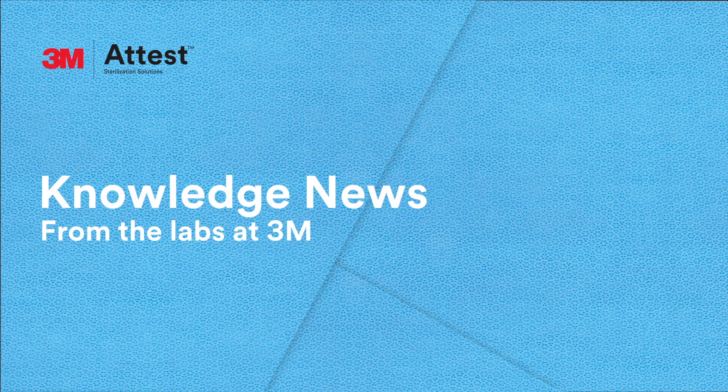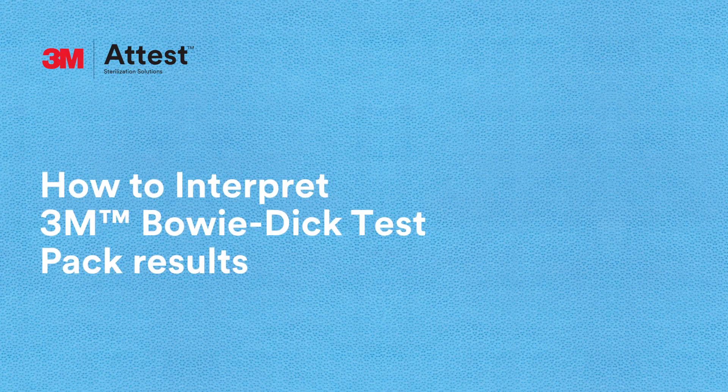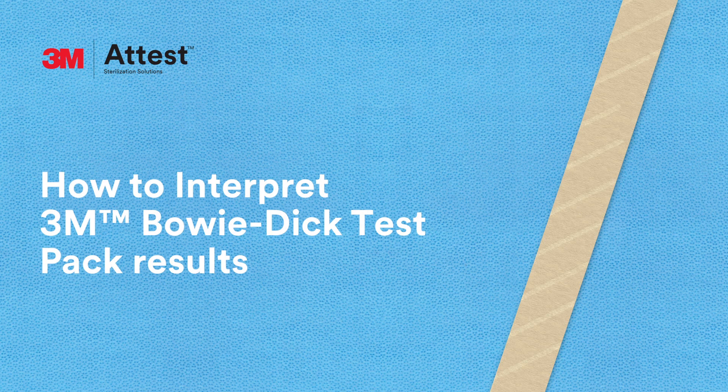Hi, I'm Steve. Welcome to the 3M Lab. We're here to help you learn more about steam sterilization monitoring. Today, we'll talk about how to interpret 3M Bowie-Dick Test Pack results.